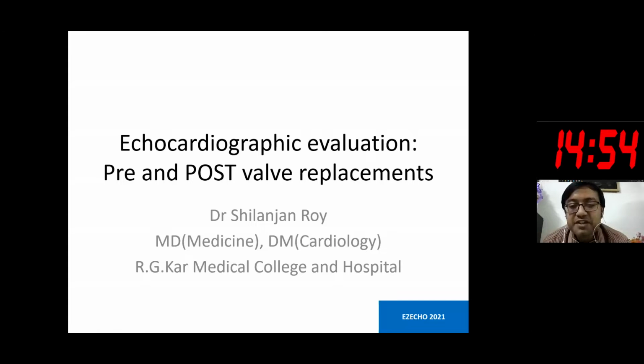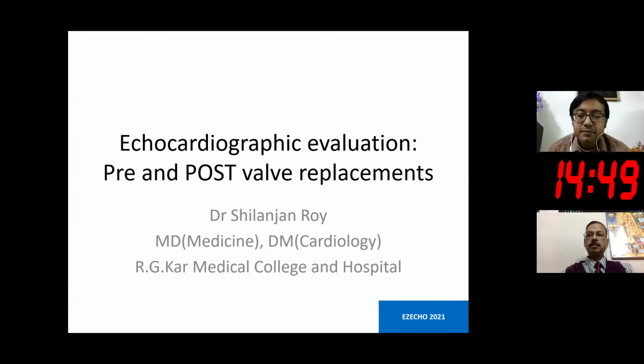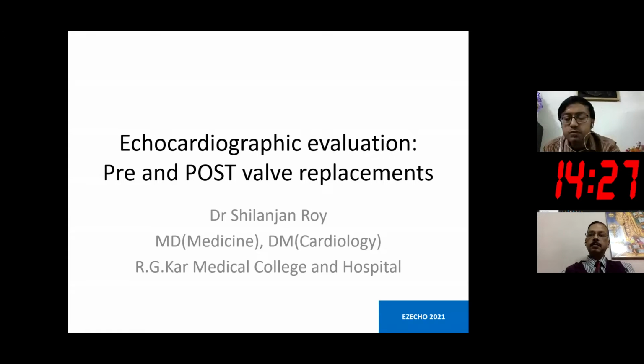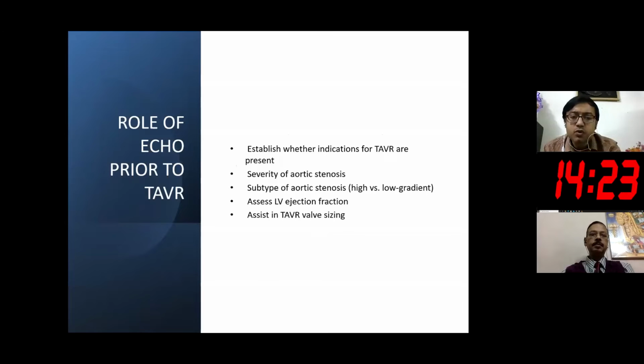Though it's a very big topic, I'll try to very briefly summarize the important points within a short span of time, along with the important clinical caveats, mainly through small videos and illustrations. Because pre-valve evaluation is a separate assessment altogether, I will mainly focus on the post-valve replacement echocardiographic assessment, both TTE as well as some TEE images which are pertinent to certain cases. Regarding pre-valve replacement, I'll mainly focus on the emerging role of echo prior to TAVR.